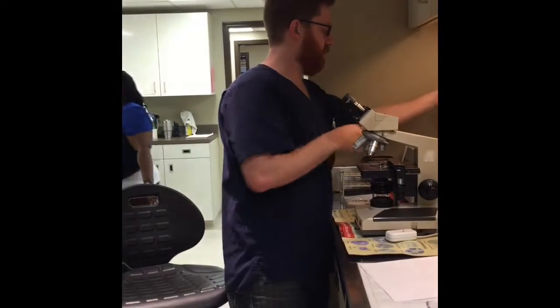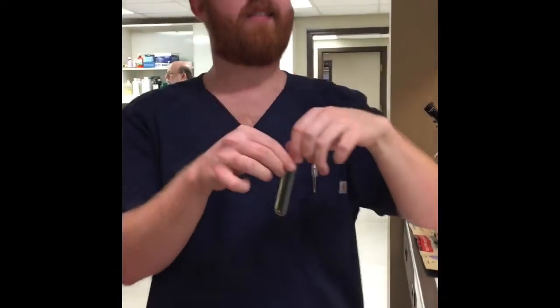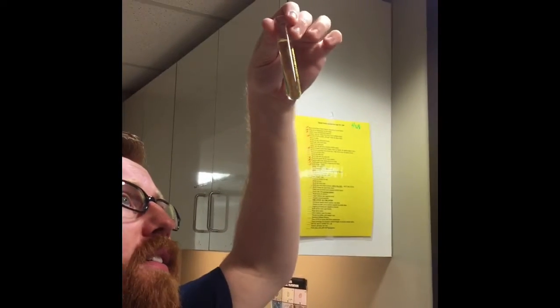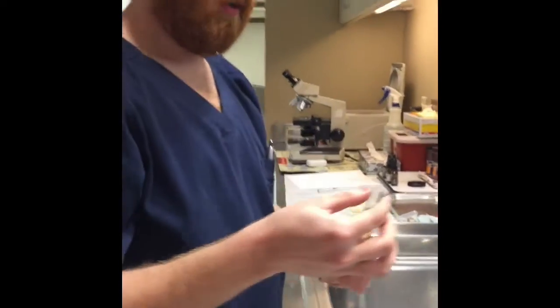And it just finished spinning. I'm gonna go ahead and get it out. Take a look here, see if we see any kind of sediment. Looking for a button. I don't see much going on here, but just to be precautionary, I am gonna go ahead and take a look at the sample under the microscope.